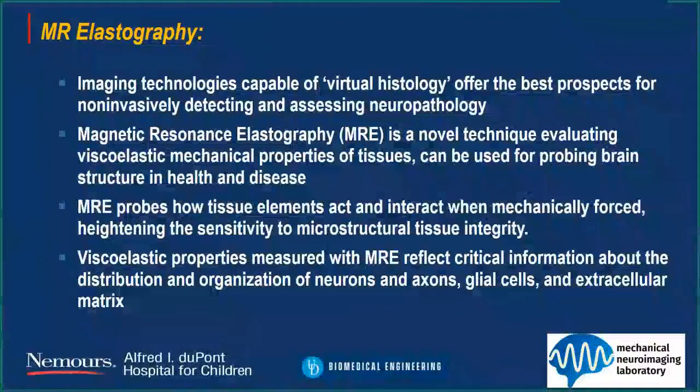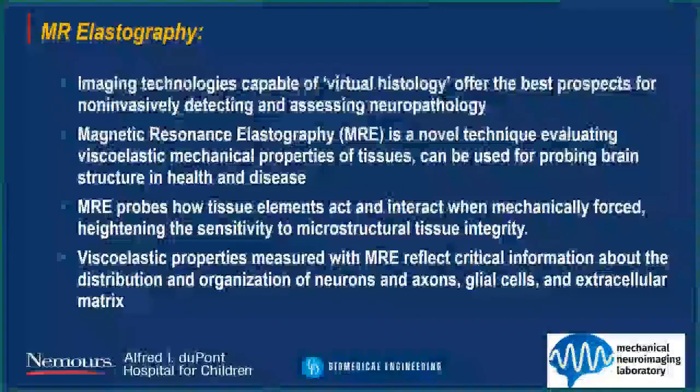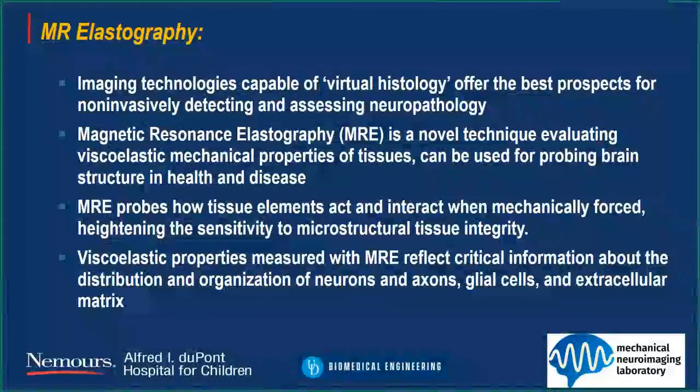Viscoelastic properties measured with MRE reflect critical information about distribution and organization of neurons and axons, glial cells, and extracellular matrix, giving us insights into the histopathology of neoplasm or any disease of the brain.